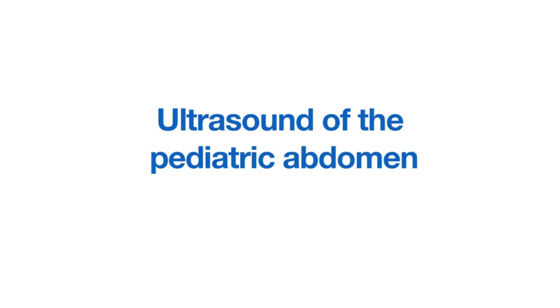This video demonstrates how to set up and perform an ultrasound scan of the pediatric abdomen.